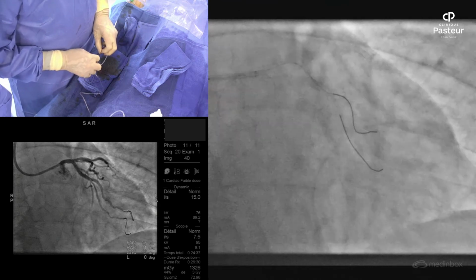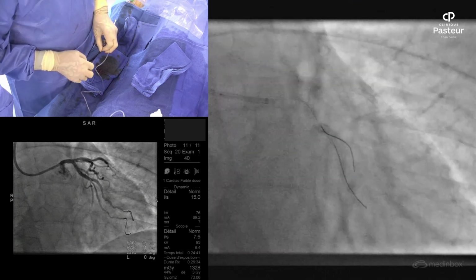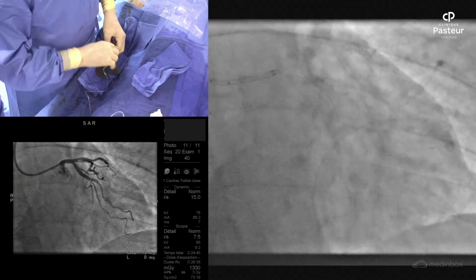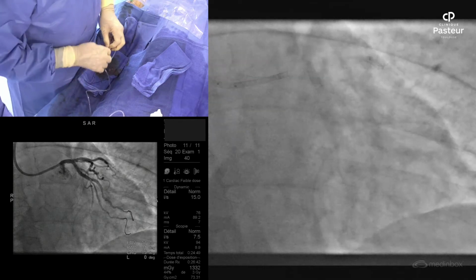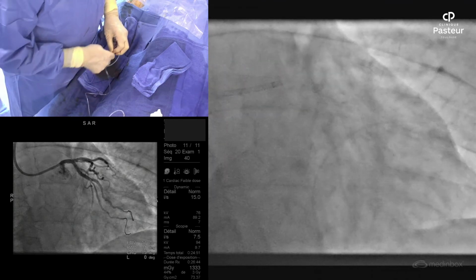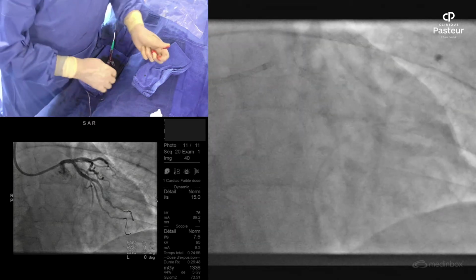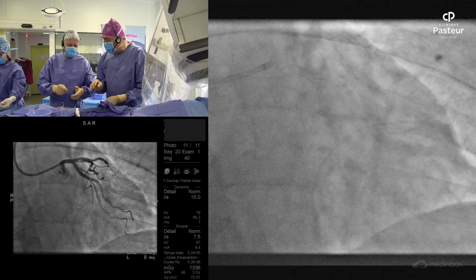And you recross. We do the wire. So this one is, but you see we have two loops. Yeah, there are two loops. So we remove everything. Sorry for that. But when it's too complex, we have to start from zero. So give me a wire, one of the both wires, the one which is the least crumpled.